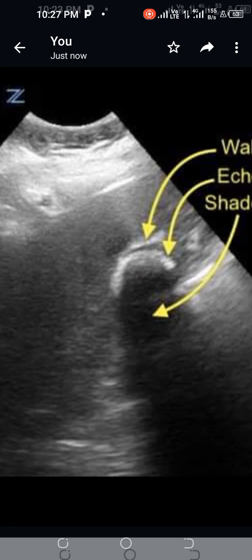This sign is very important to determine whether there are gallstones or not, as it represents cholelithiasis. Every sonographer should know the Wall Echo Shadow sign. Thank you very much.